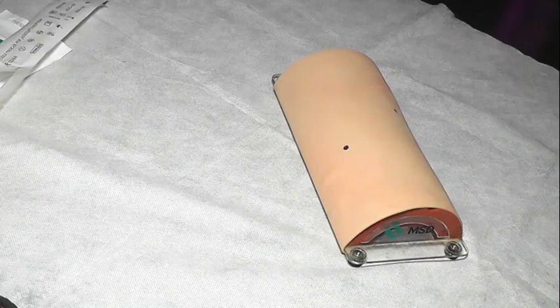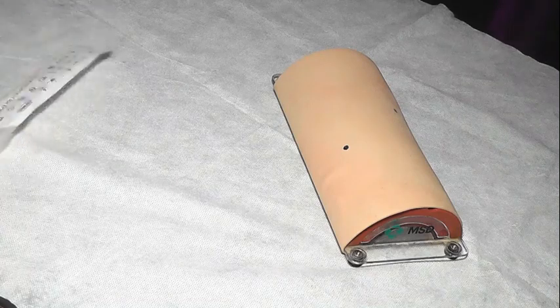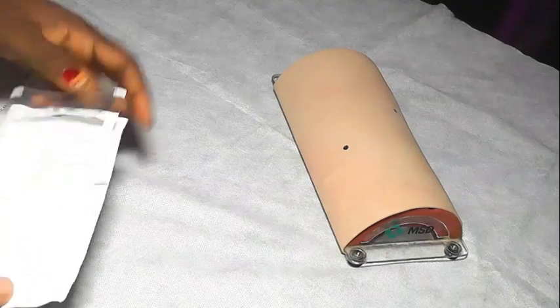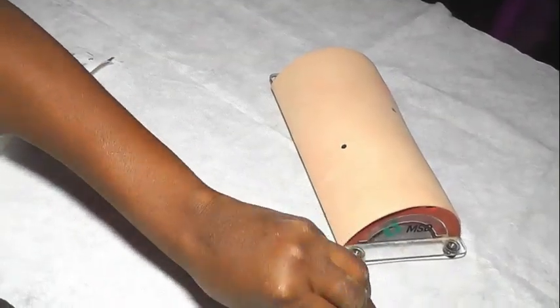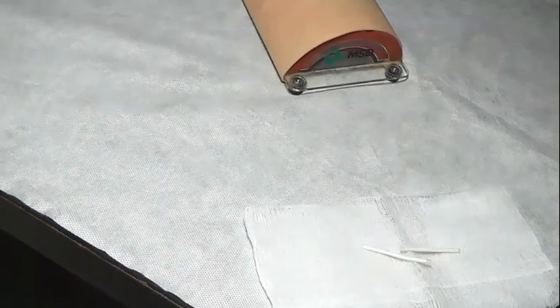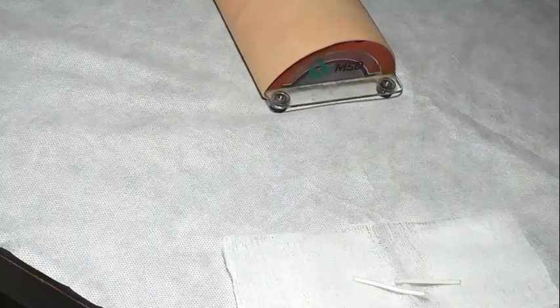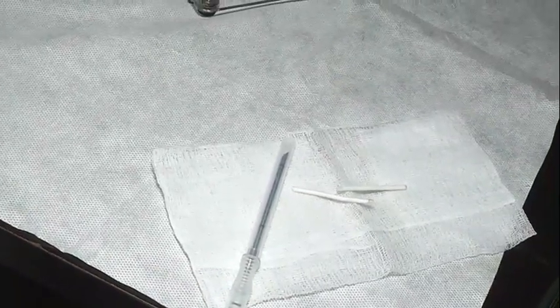While you are waiting, you should have your sterile gauze, and then you should empty the Jadelle. It's usually 2 rows, so you don't touch the inner aspect of the pack of the Jadelle. You place it on the sterile gauze. Alright, so you can see I have 2 rows of Jadelle on the sterile gauze. And then this is my trocar for the insertion. So you also place it on the sterile gauze. Then you go ahead and put on your gloves.